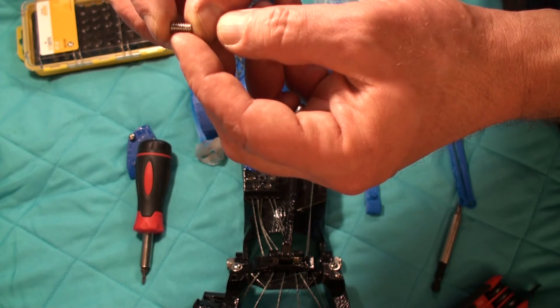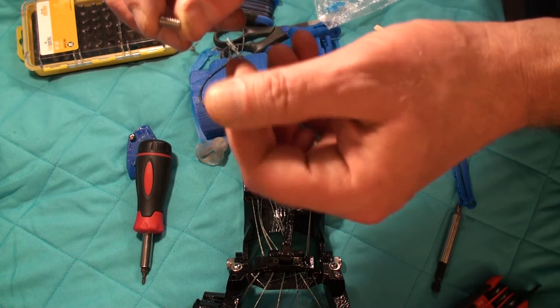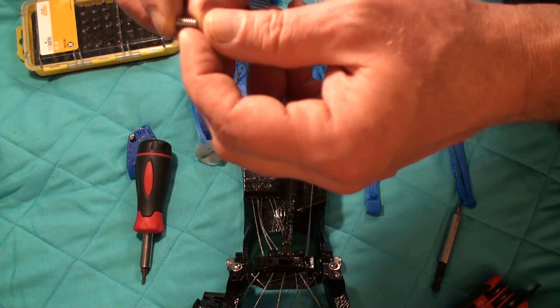The set screw looks like it's about three-eighths of an inch long, maybe almost a half inch.